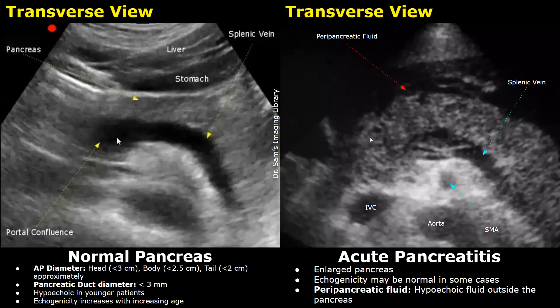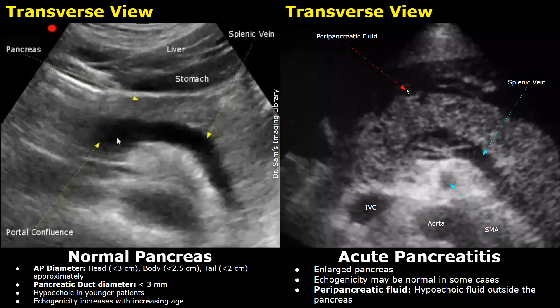The pancreas is inflamed, so it will be enlarged — the pancreas appears swollen. You can clearly see an enlarged pancreas. Also, there is hypoechoic peripancreatic fluid, which is normally not present. A swollen pancreas with peripancreatic fluid strongly suggests acute pancreatitis. In a few cases, the echogenicity of the swollen pancreas may be normal.